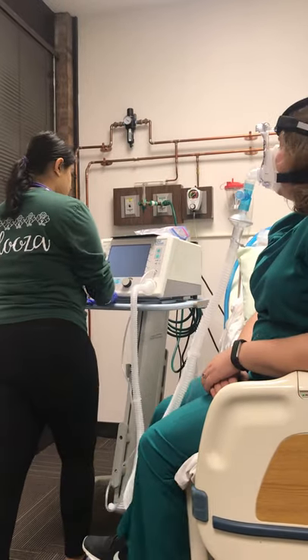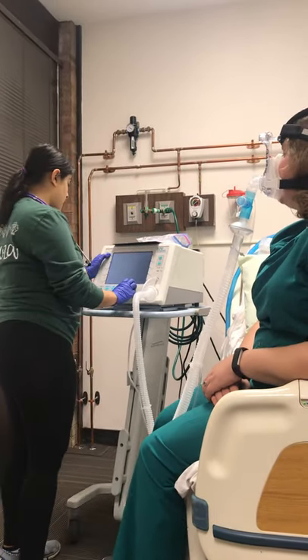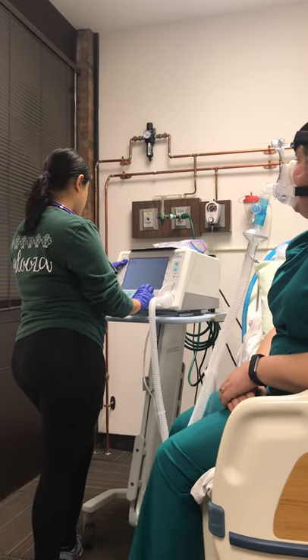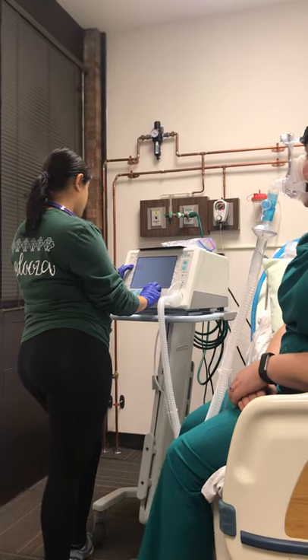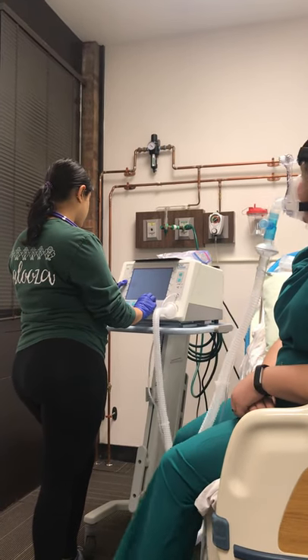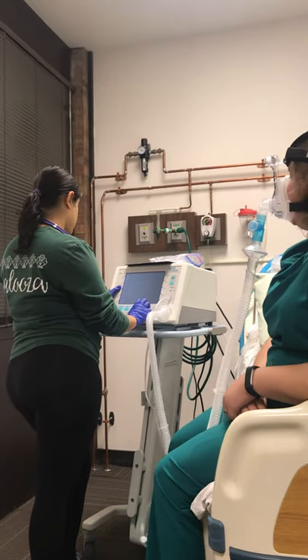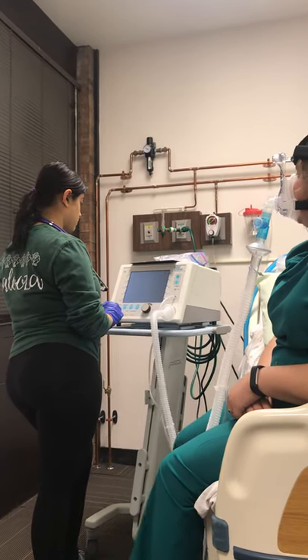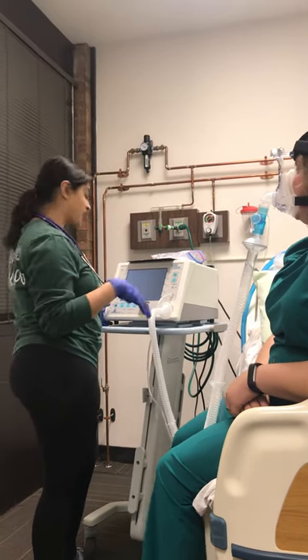So I'm just going to switch you to the ST mode. I'm going to set the IPAP to 14 and the EPAP to 7. We're going to set the rate to 10. I'm just going to activate the new mode. You're going to feel more pressure.